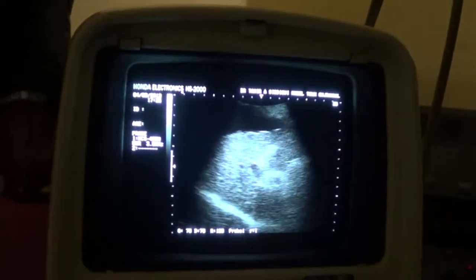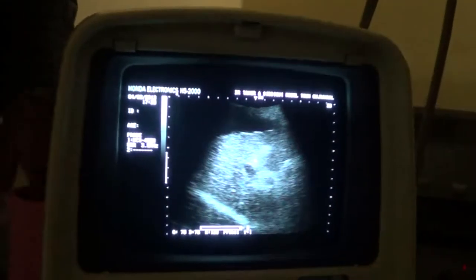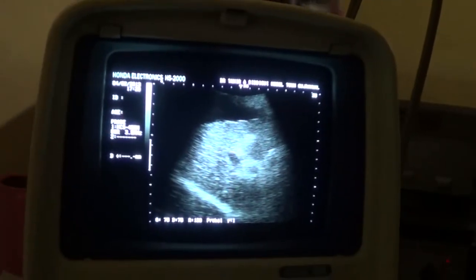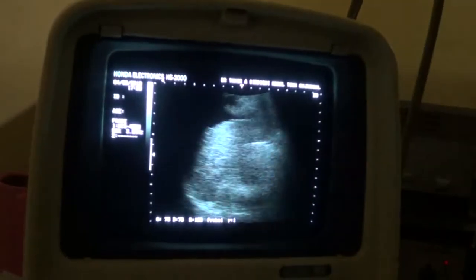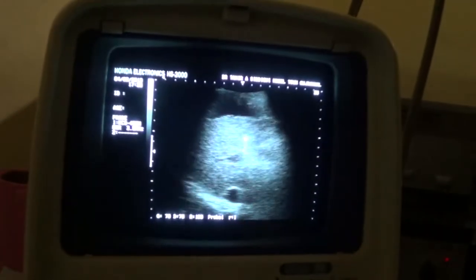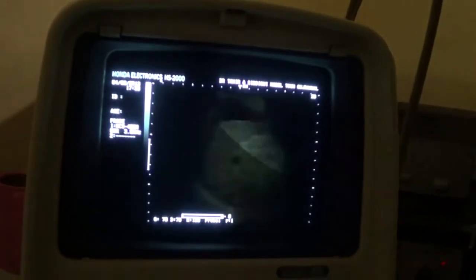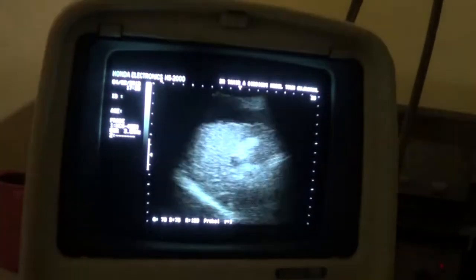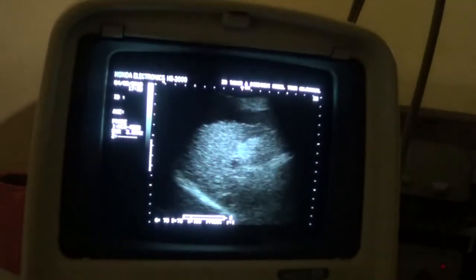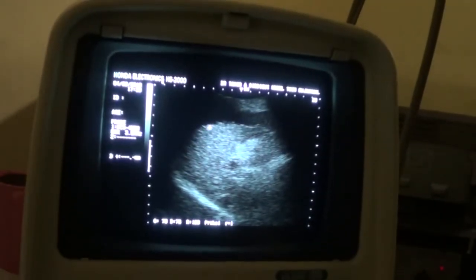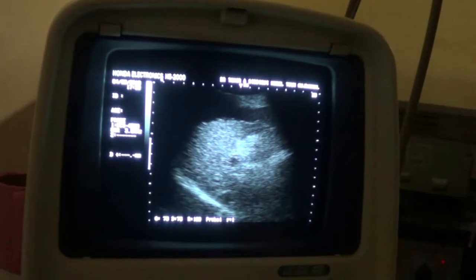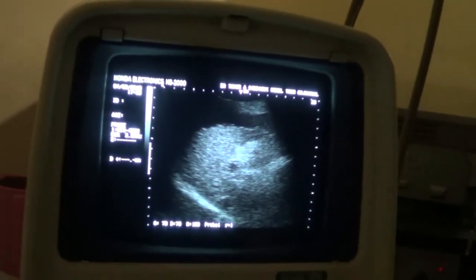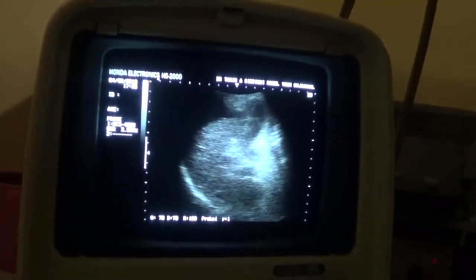This is a short video segment showing you a cirrhotic liver with nodular outer surface. It is surrounded by ascitic fluid. This black area is all fluid. See the outer surface of the liver — very characteristic of the macronodular pattern. This is all ascitic fluid surrounding the cirrhotic liver.